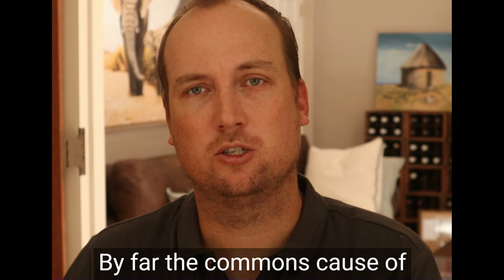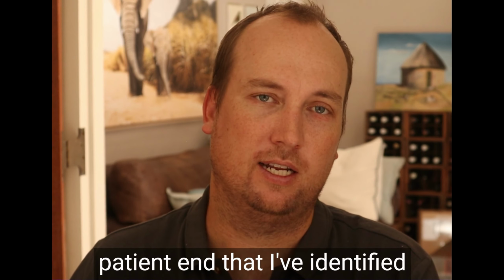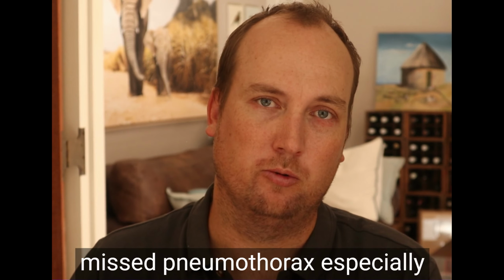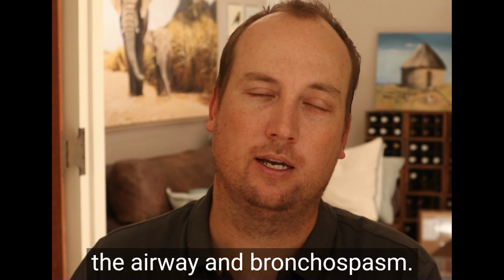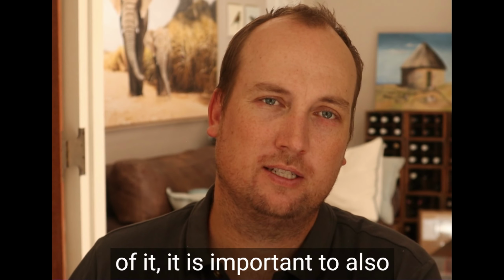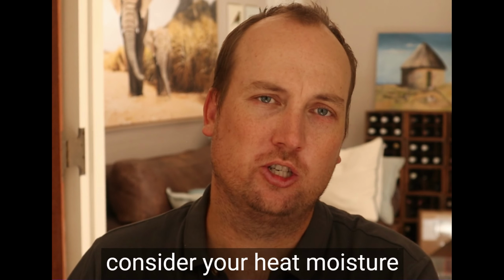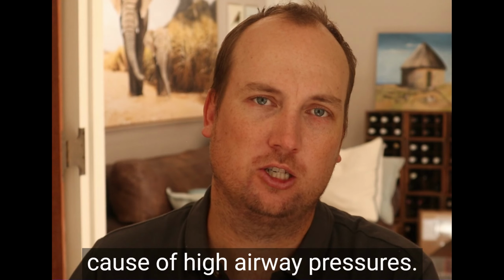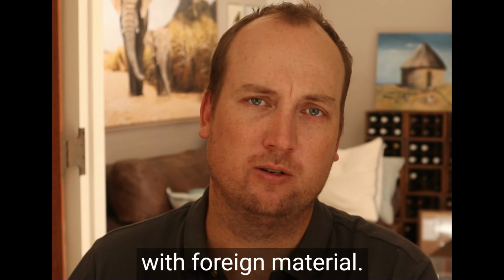By far the commonest causes of high airway pressures at the patient end that I've identified are endobronchial intubations, a missed pneumothorax, especially in trauma patients, secretions in the airway, and bronchospasm. Just as an aside, while I think of it, it is important to also consider your heat-moisture exchange filter as a potential cause of high airway pressures. These devices can become blocked or clogged with foreign material.